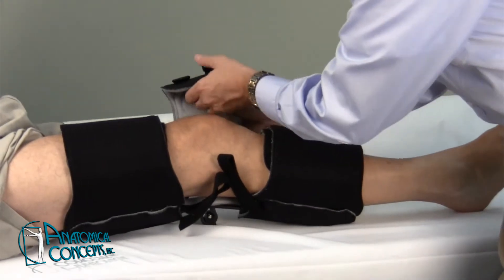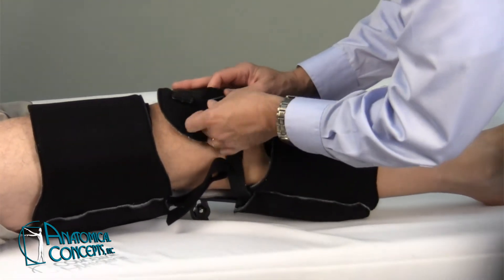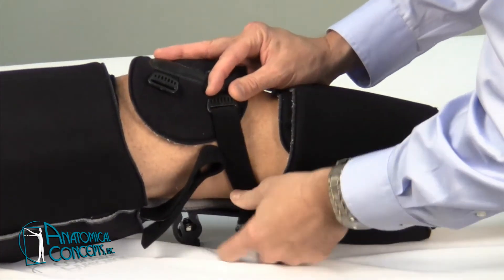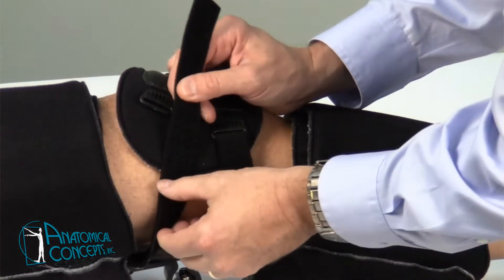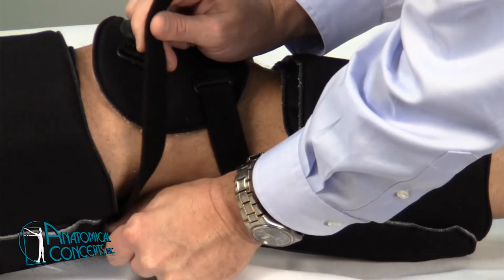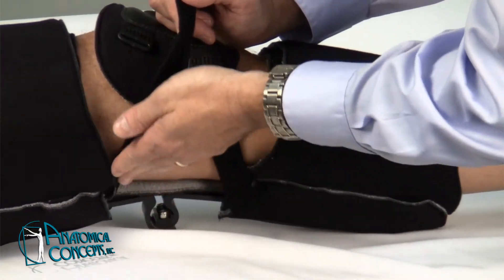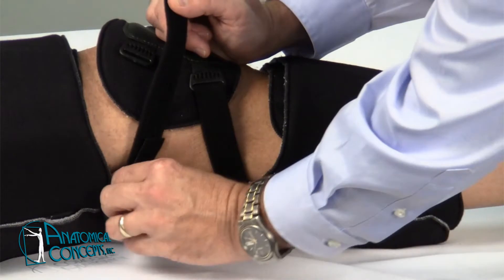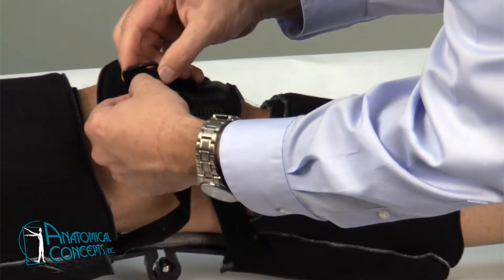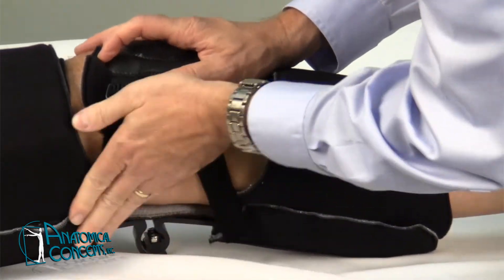Then go ahead and fasten up the knee pad. Typically you'll start with the bottom strap first through that buckle on the knee pad and fasten that up to the Velcro. You can also change the length of the strap — we've already cut these down, but if you need to vary the length, you can slide it through a slot posteriorly, move the strap length, and reposition it. Then go ahead and fasten the upper strap on the knee cap.